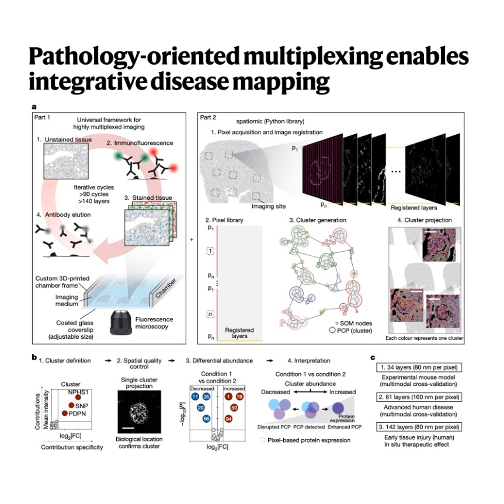Think about it like this. Cell-level analysis averages everything within the cell boundary. It tells you the cell is, say, stressed. Pixel-level clustering, because it's working at 80 nanometer resolution, can pinpoint where inside the cell that stress is happening and what proteins are involved in that specific spot. Like finding the specific faulty component inside the machine, not just saying the machine is broken.